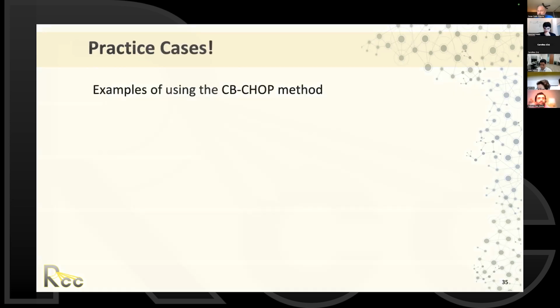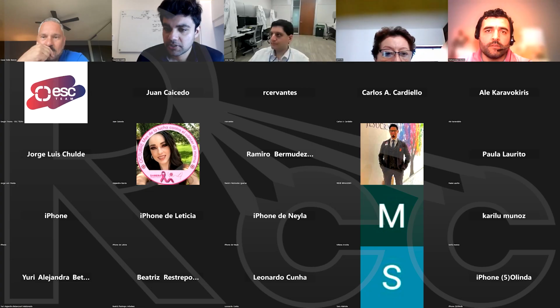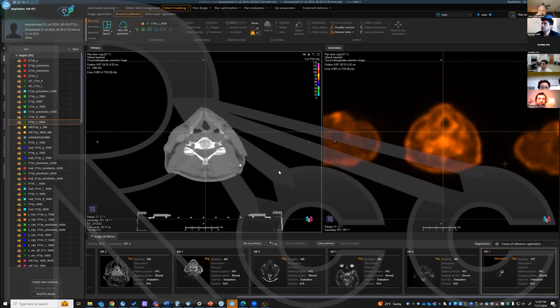Now we're going to go through some practice cases. I don't know if you want to add anything before we go to the practice cases. Oh, let's do it. Okay, let's do it. Awesome. I'm going to start. I will share my screen. Perfect. And let's walk through using this method. I don't think we have a lot of time remaining, so I'll go through this a little bit fast, and then Dr. Safavi also has a case for us.